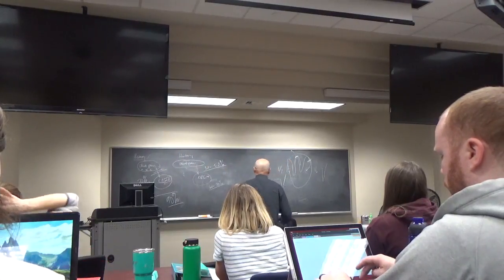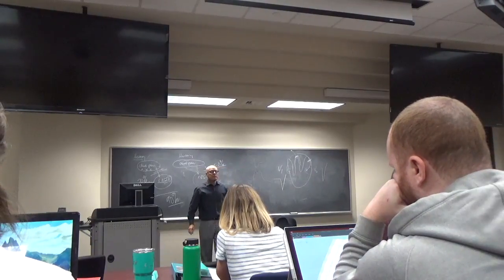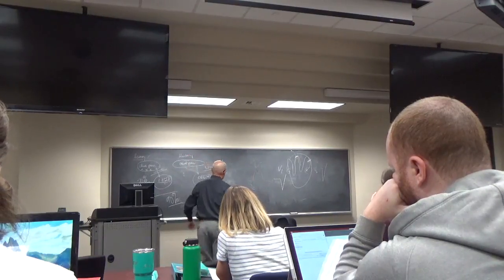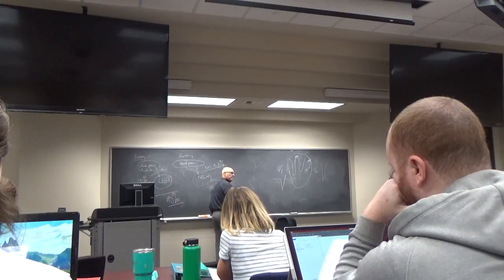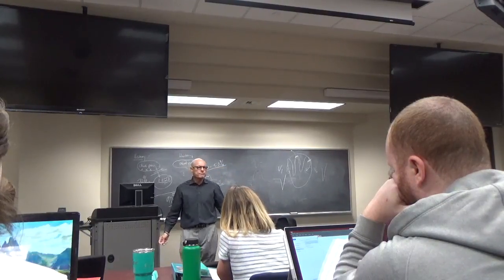So if I have two PA students, and I give them this. I say, here are these coronary arteriograms. Just look at the LAD, and you tell me what the lesion is. It's either positive if it's greater than 70%, or negative if it's less than 70%. That's really all we're going to ask you to do.